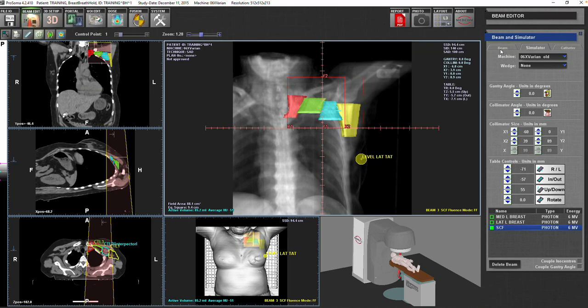I personally like it because it gives me confidence that patients treated with field-based are not compromised in terms of the coverage of what I want to cover, compared to another patient who will have a VMAT or be treated with full target volume delineation only, and you expand it with a PTV. So by doing this, I feel more satisfied, I have to say.